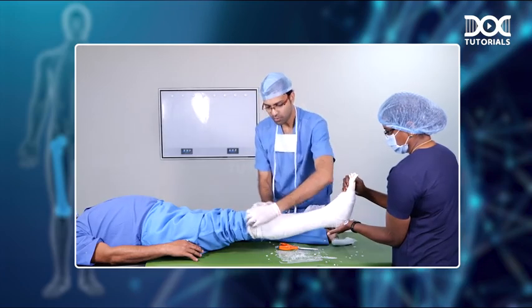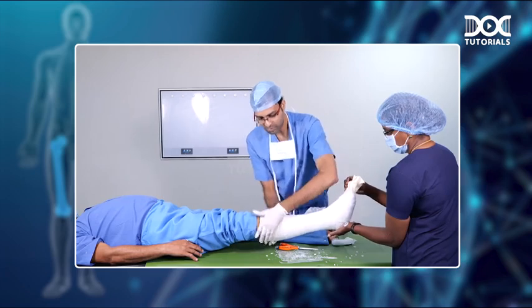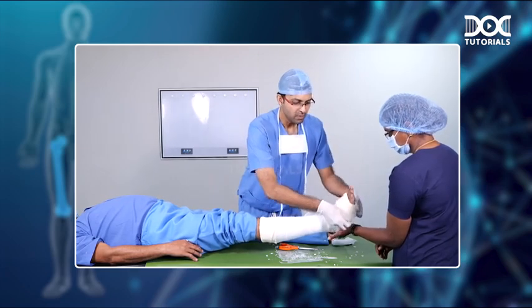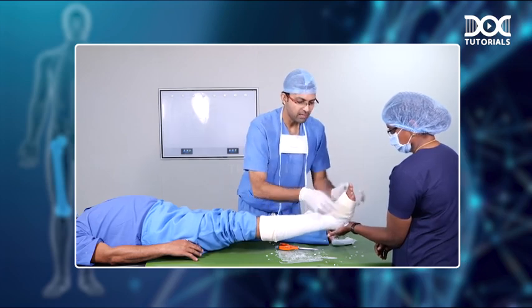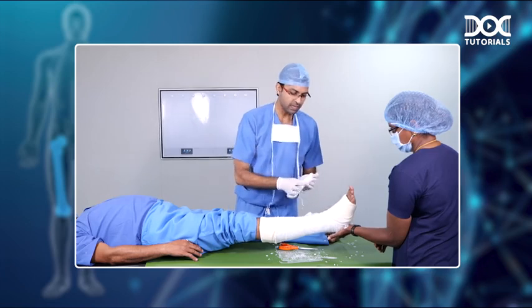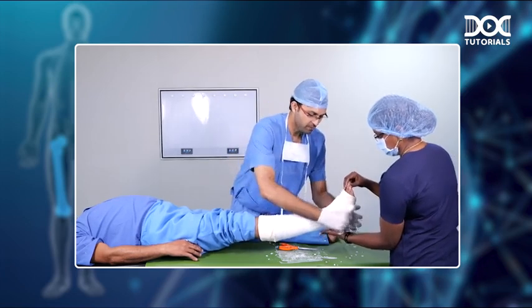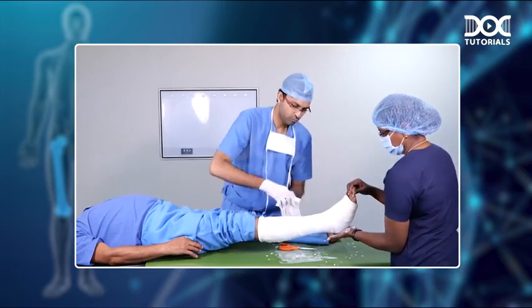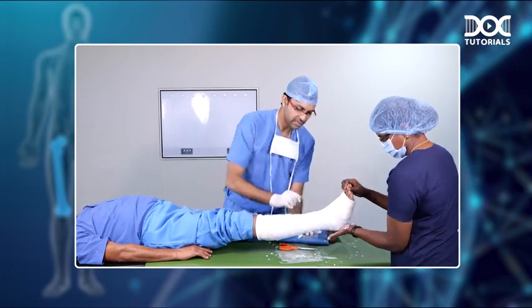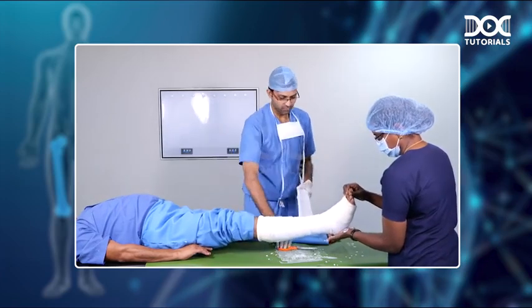You can roll the edges of the stockinette like this, which will give a very nice finish to your slab. That is why I told you earlier, you have to take the stockinette a little bit longer than the size of the slab. And once you do that, you can again use your bandage to roll around the leg and fix the slab. Once you feel that the bandage is sufficiently tight, you can just stop and tie it off.